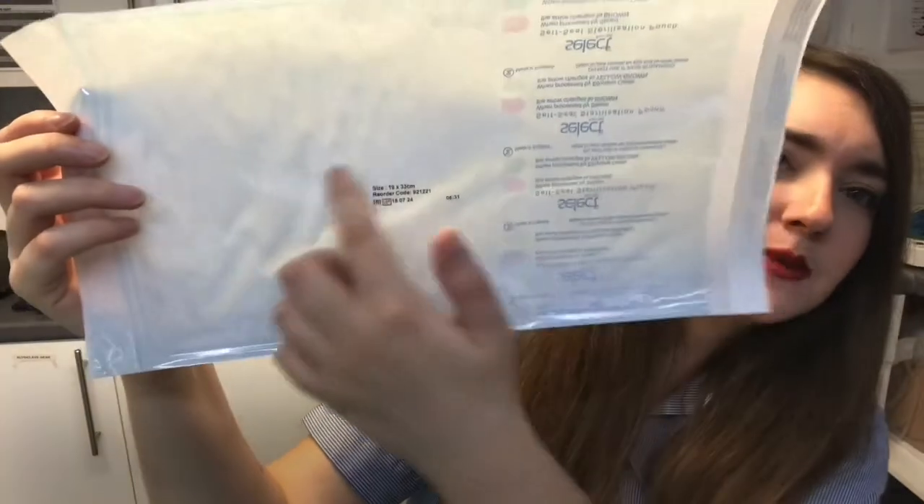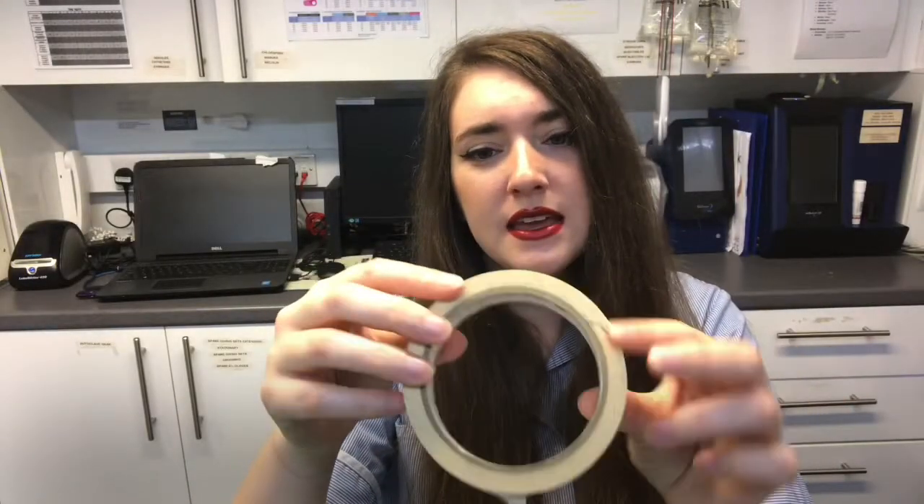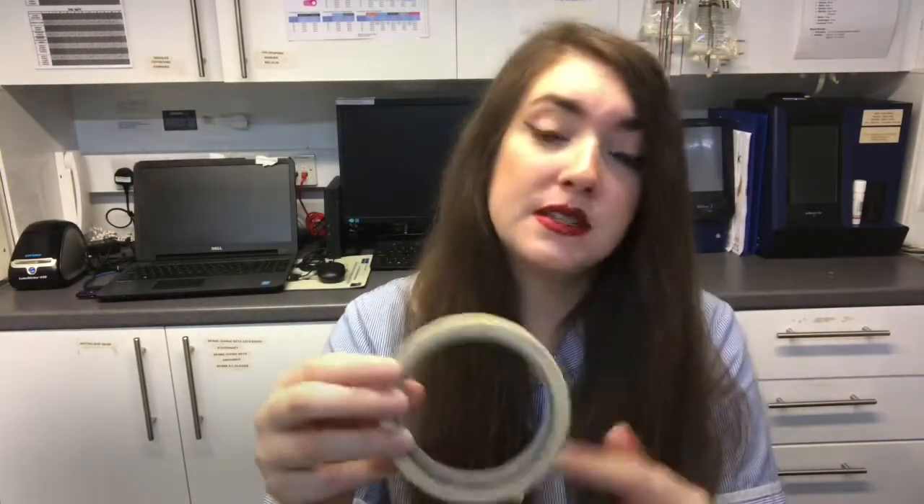We also need a sterilisation pouch. This is what it looks like from the front — you would place the kit in this way. On the back it also has another indicator strip that will change colour once it's been autoclaved. We also have some tape that will change colour once it's been through the sterilisation process.